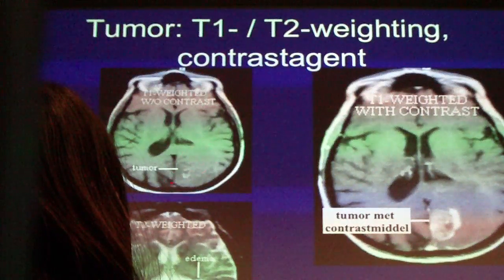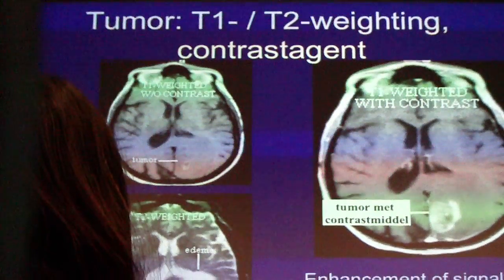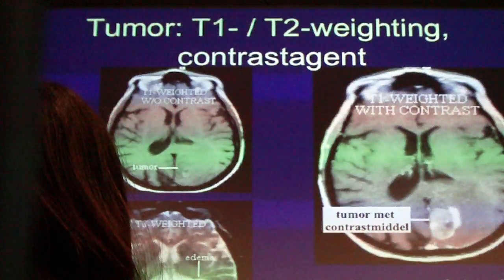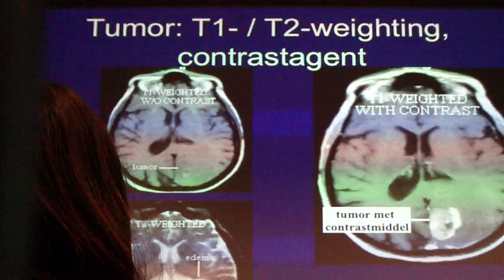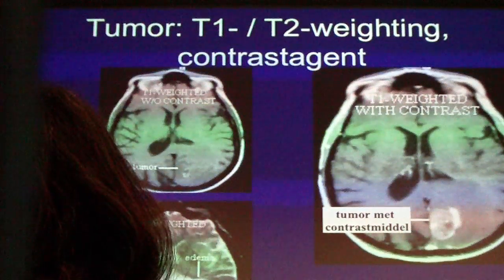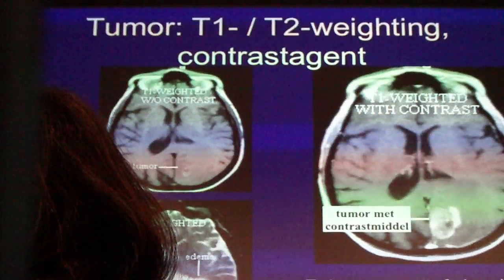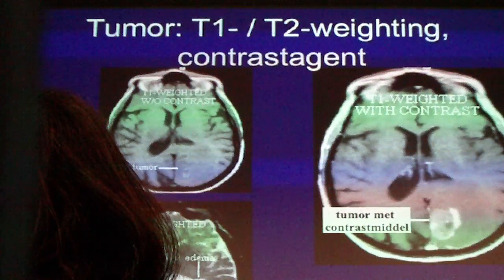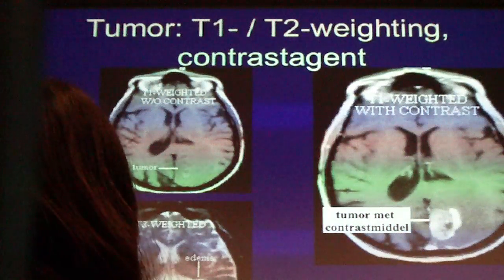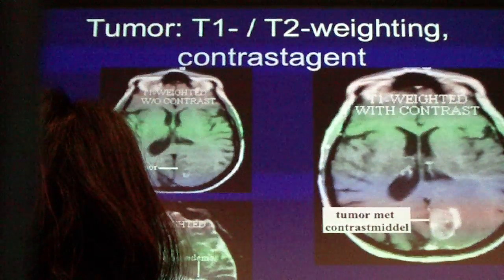So you don't have a lot of contrast. If you use a contrast agent in the plasma, you can inject it in the bloodstream, that is shortening the T1. It means that the magnetization in the blood will very rapidly relax back to the equilibrium. So even with a short repetition time, you will always achieve complete relaxation. So that means that you have high intensity of the bloodstream.